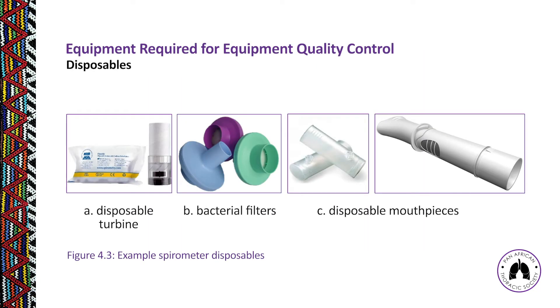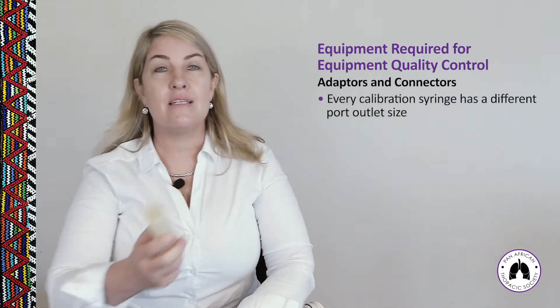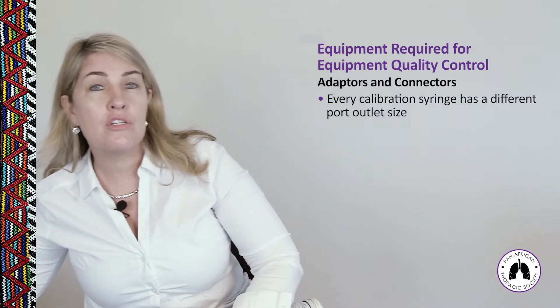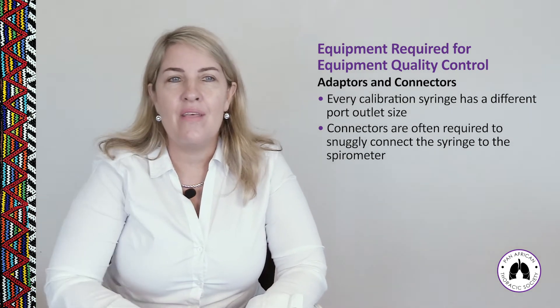You will need various disposables such as bacterial filters and disposable mouthpieces. When doing a calibration check, you need to attach every connector, bacterial filter, and mouthpiece to the spirometer that you will be using during the actual test. You will also need various adapters and connectors — without the correct ones, you won't be able to attach the calibration syringe properly. The connection between the syringe and the spirometer must be absolutely airtight with no leaks.